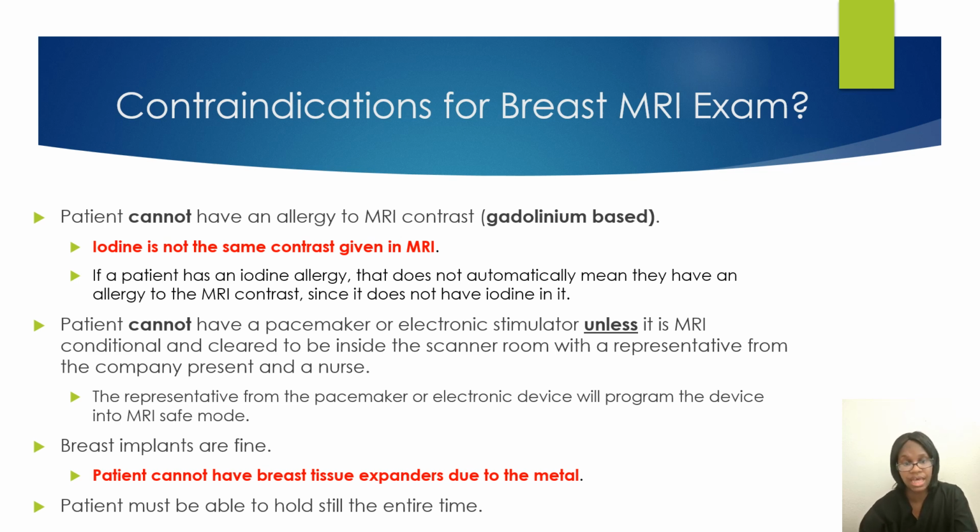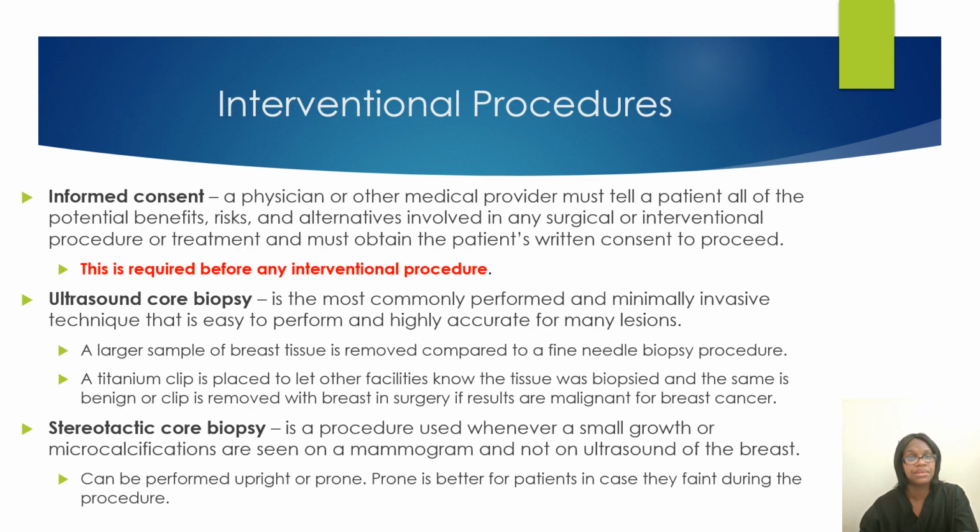Breast implants are fine, but if the patient has breast tissue expanders, they are not fine. The patient will have to hold still the entire time.